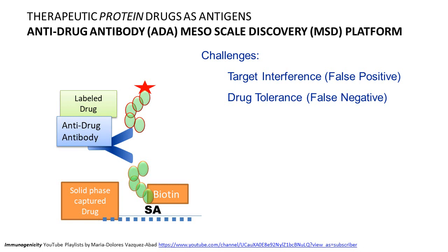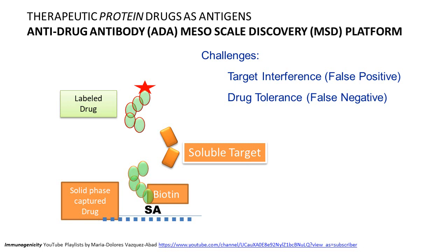Let's talk about target interference. Your drug is designed to bind a target. When that target is soluble, and you're detecting the blood from your patient — say this patient has absolutely no anti-drug antibodies but they have the soluble target — for example, if you're using an anti-VEGF as your drug, the patient has VEGF circulating. Or an anti-TNF, the patient can have TNF circulating in the blood. When you use the blood on this assay, because you've designed your drug to bind that soluble target, the soluble target binds the solid-phase captured drug and will also be detected by the labeled drug. This is why target interference produces false positive results.